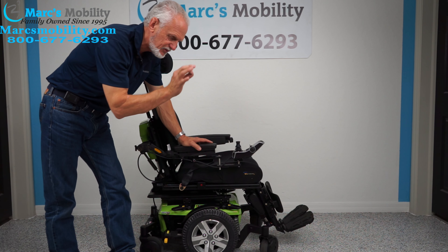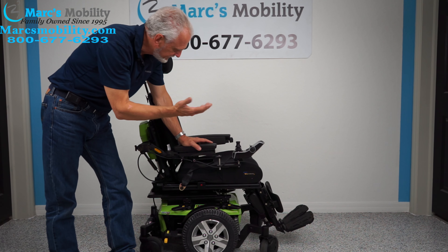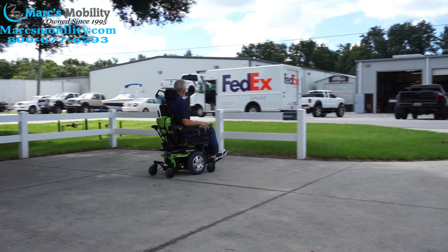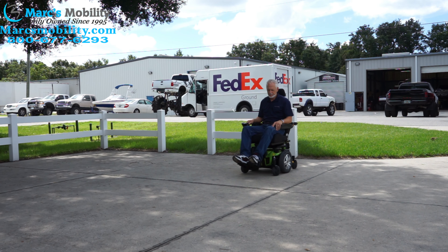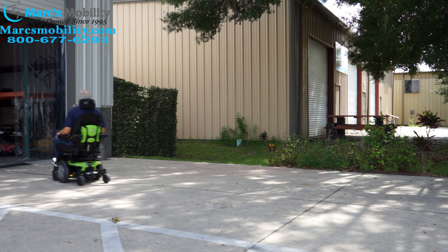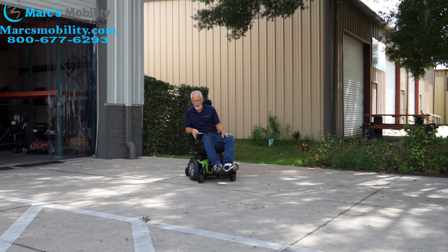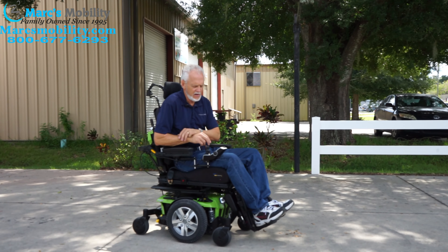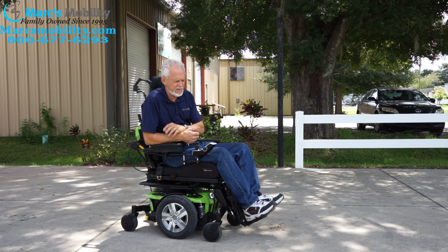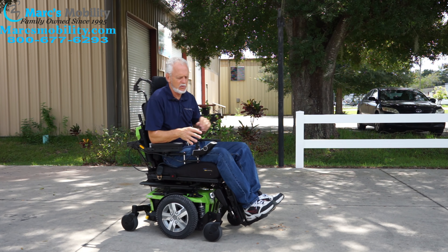So if you're looking for a nice power chair with electric tilt, electric recline, electric feet, with one-mile, and this is the color you like, it's ready to go. This is the Quantum Edge 2.0 neon green — it has an electric tilt, electric recline, electric back, six miles an hour at the top speed. These are high-quality chairs; the suspension is unbelievable in these chairs.